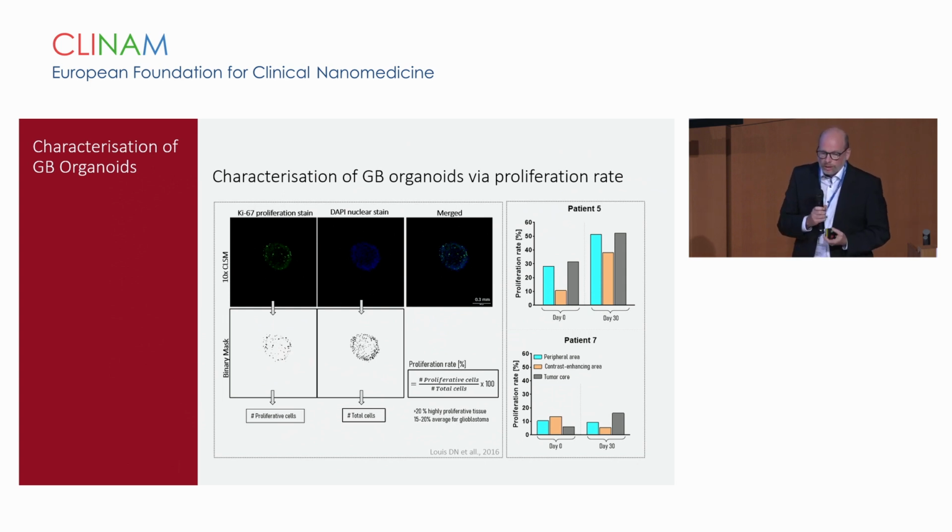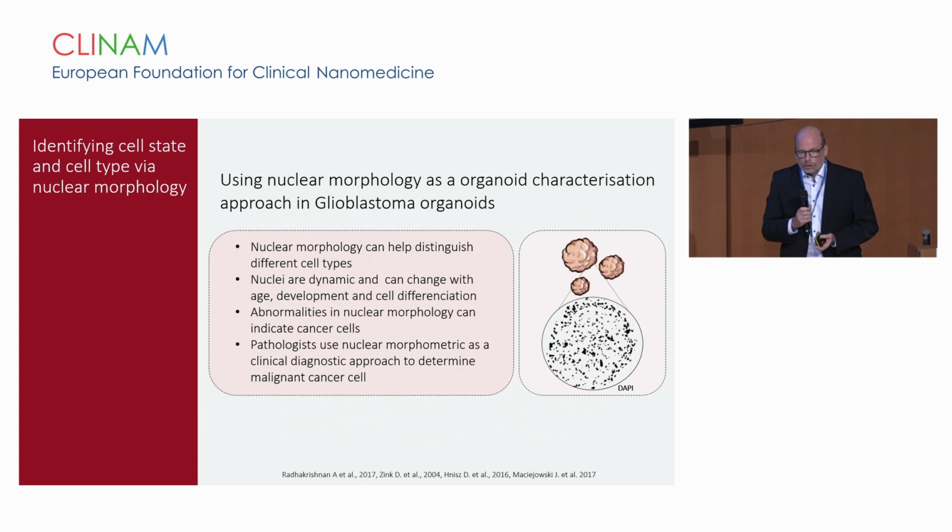This is what we want to deal with and anticipate, hopefully in a long-term perspective, having enough biopsies so that we can also do some advanced statistics on it in order to describe and quantify this heterogeneity. Here is just one example of how we assess the proliferation rate by classical staining. I think these are all well known in this audience. What we also try to do is to go a step beyond the classical pathological analysis.